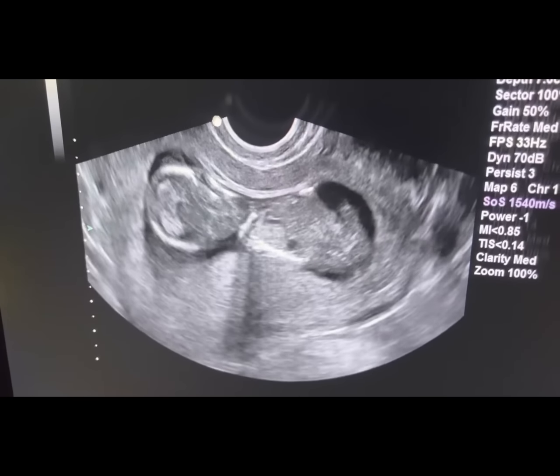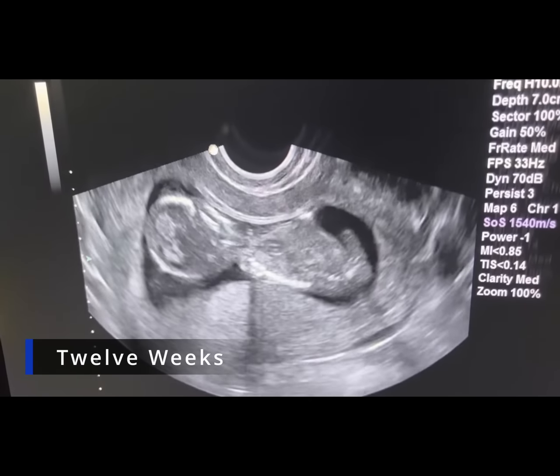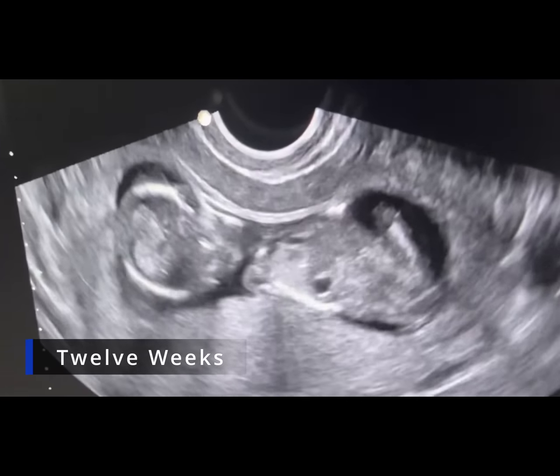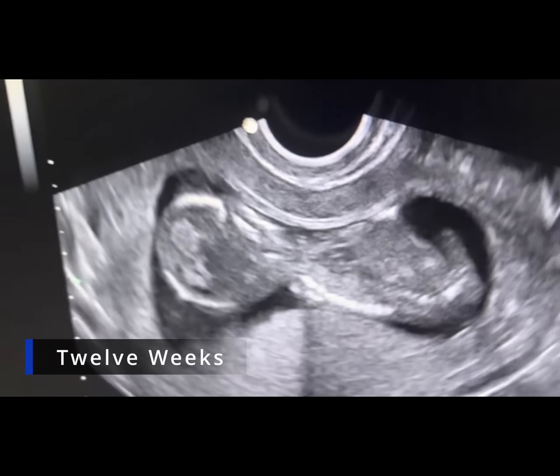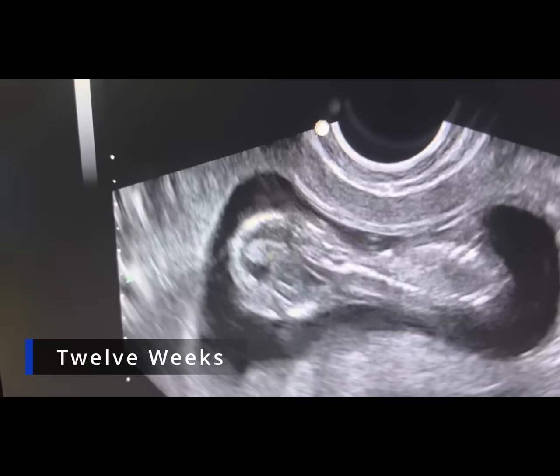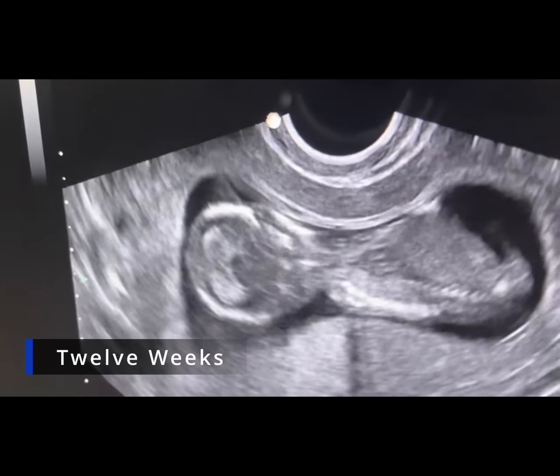Today we have a beautiful fetus over 12 weeks gestation. It's starting to look like a little person right now. You can see the heart beating. In fact, there are 4 chambers. It's a fully shaped heart. If we go to the head, we'll be able to see the ventricles and the shape of the brain that's forming. Beautiful brain. The face is there.